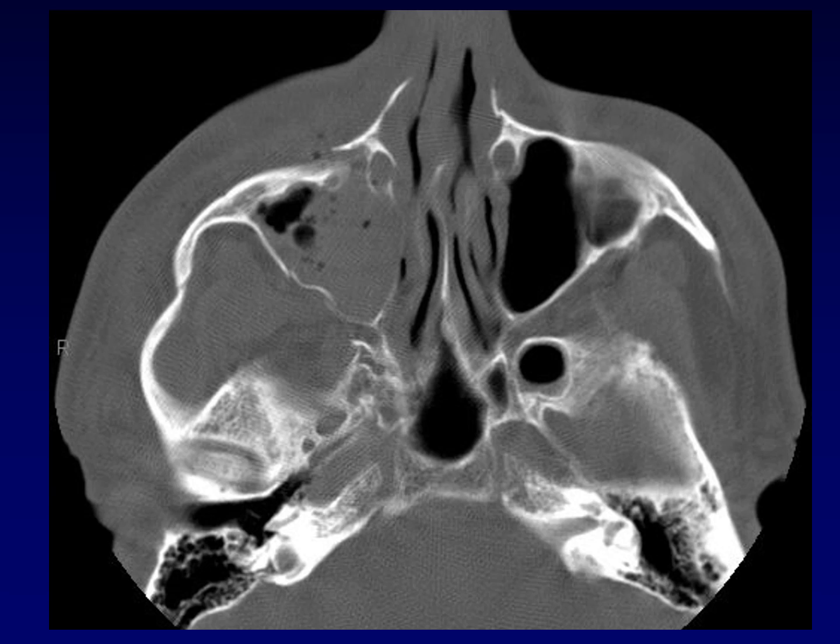Here's a situation in which the zygomatic arch is deformed. The curvature of the arch is not the nice smooth uniform curvature we are accustomed to, but instead sweeps in and then back out. You might be tempted to say that's an old remodeled fracture with no acute fracture line, but in fact this is an acute fracture. This is an occult fracture based only on lucencies, so look at deformed arches with skepticism. The other components of the tripod fracture visible here are another clue that this is an acute fracture.